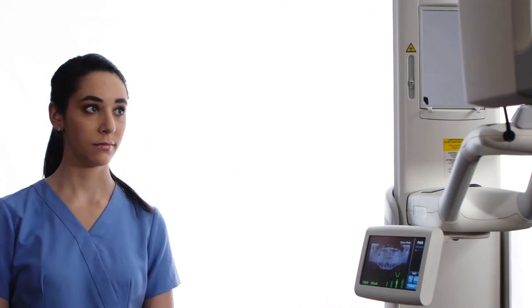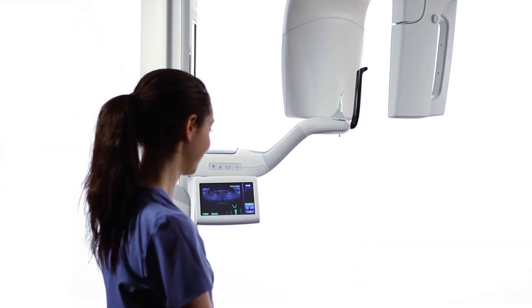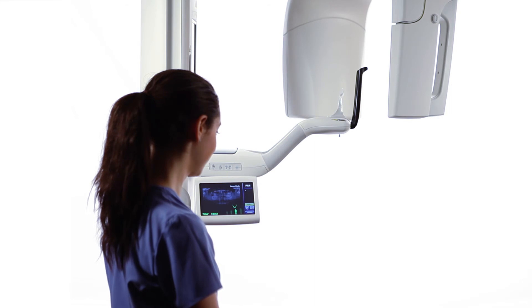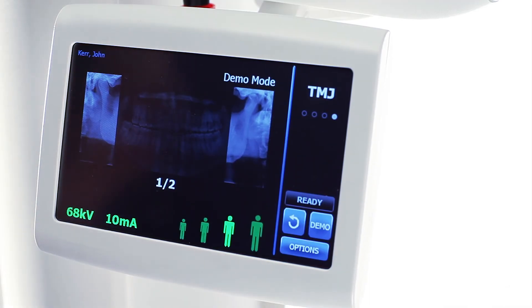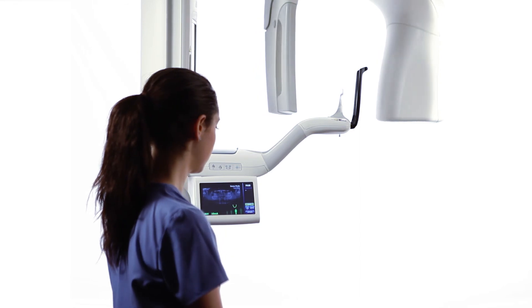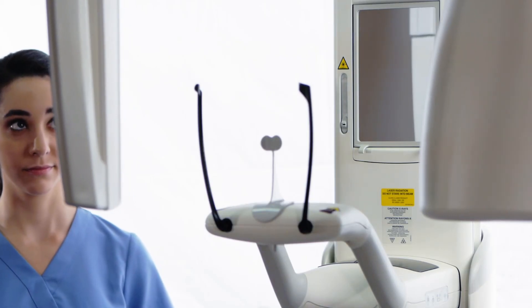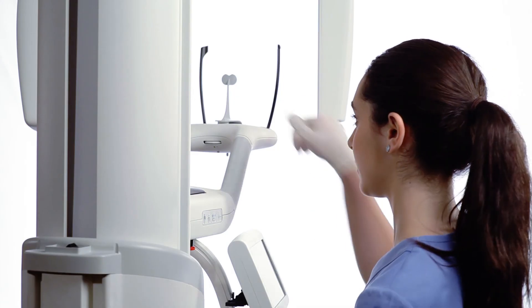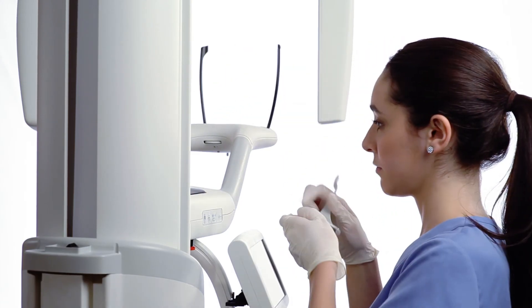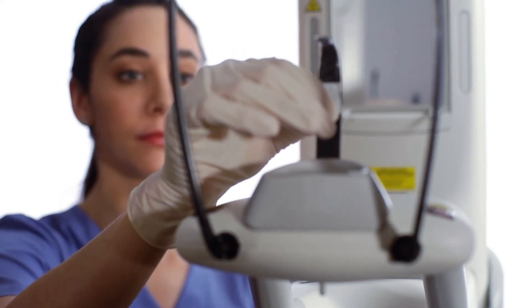At the end of an examination, the overhead structure is in the patient exit position. The gray ready indicator verifies this. Press the cycle button on the Vantage Touch once to bring the overhead structure to the patient entry position. If no further TMJ examinations will be performed, exchange the TMJ positioner for the standard panoramic bite piece and chin rest.